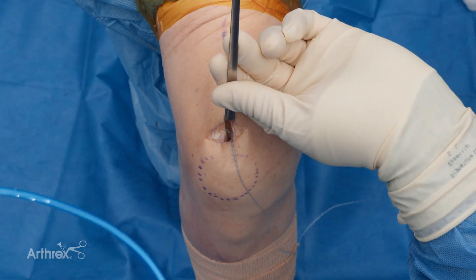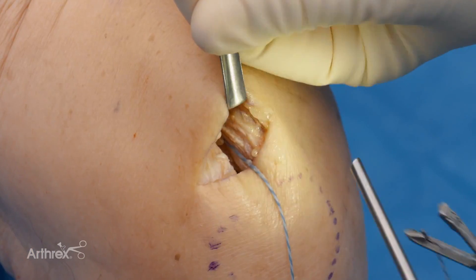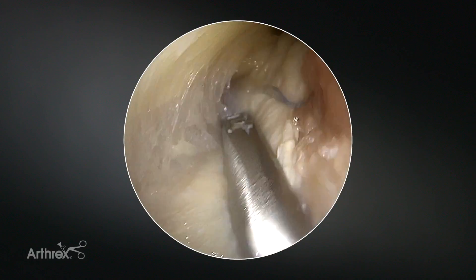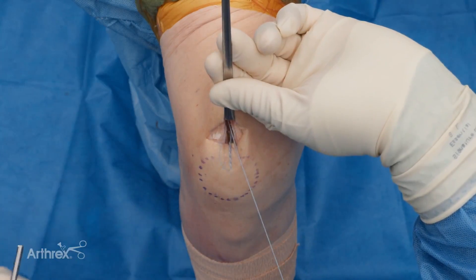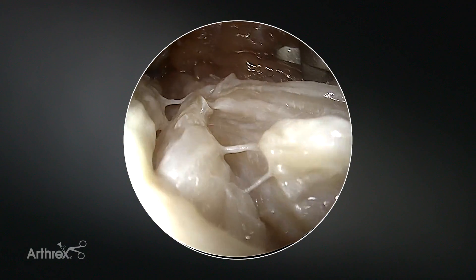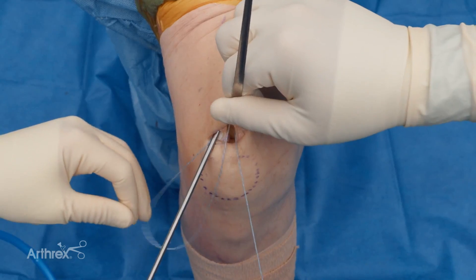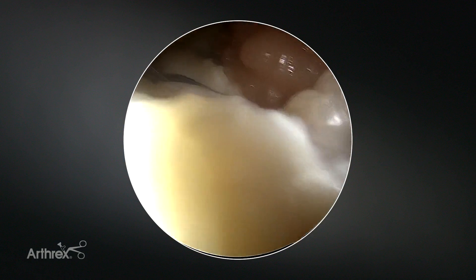Now it's simply a matter of just going back and forth, so we're going to repeat the same process. You only really need the scope for the first few passes. I'm coming in with the second inverted pass to the right side of the tendon — you can see I'm coming in. I like that bite. I'm going to grab that and pull that through.